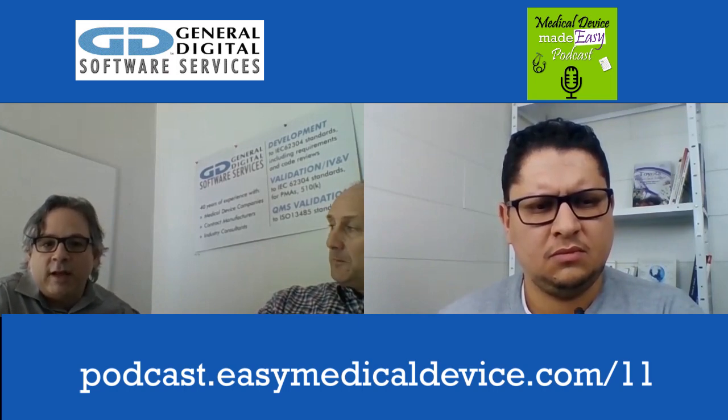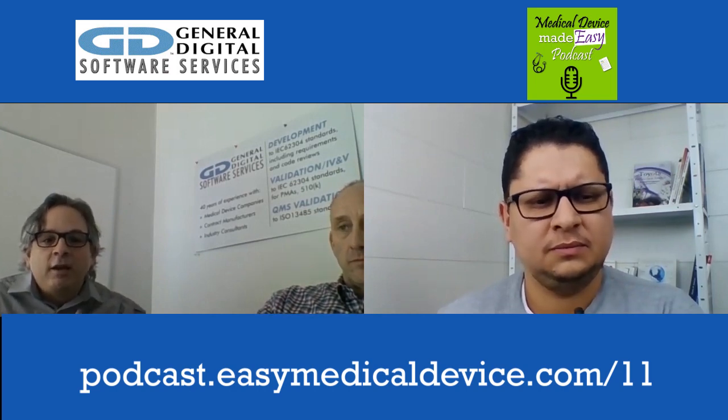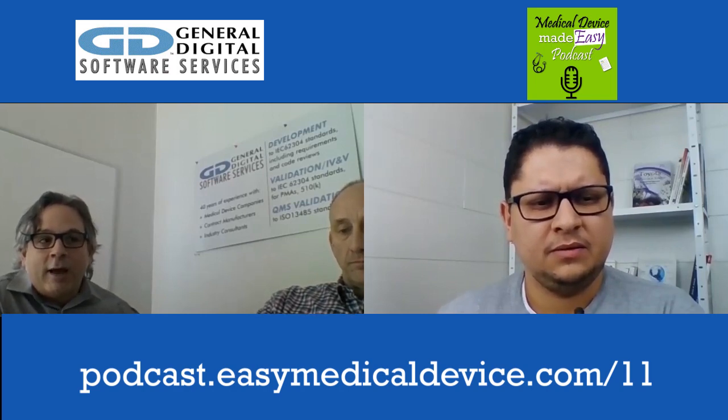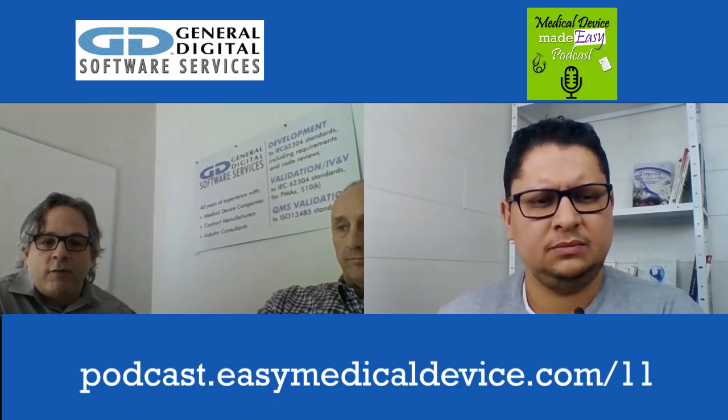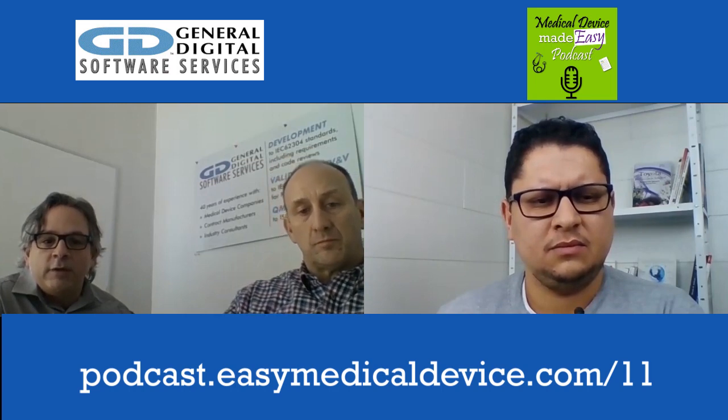The only difference with the dynamic part of it is that you have to do it in multiple fixed locations to make sure that over time it's still performing the way it's supposed to. Outside of that, there's still a lot of changes happening in terms of IV&V in relationship with AI, and a lot of things are still developing. And as always, we're keeping an eye on those new developments.